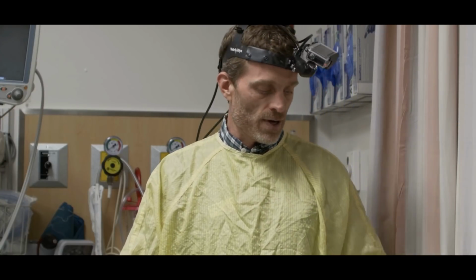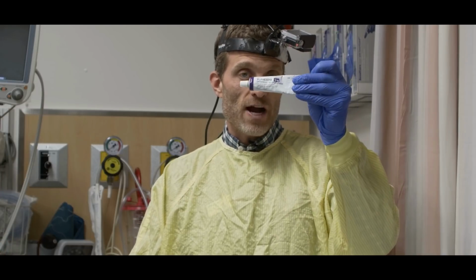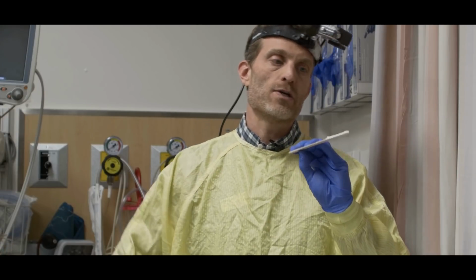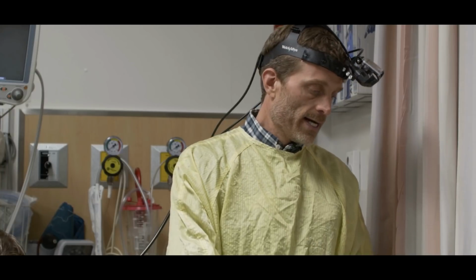Phil's been a big help sorting out the milligram dosage of 5%. That's the product for the tongue, and this is probably the most important part of topicalization. 5% is 50 milligrams per gram of ointment. So that's how we worked out exactly how much half of a tongue depressor is if you push it out in a straight line, being 80 milligrams. And we've got Leanne from nursing who is here ready to go with an IV.